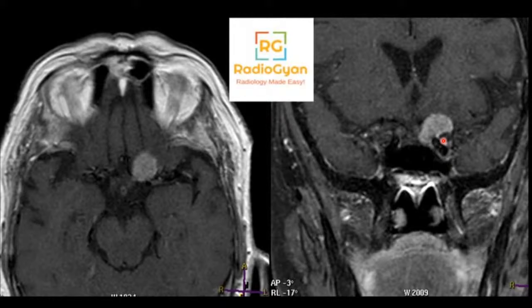Somebody said that this could be a trigeminal schwannoma. Again, that would be a bit more complex, and I'm not sure if this would be the location for a trigeminal nerve lesion. It could be one of the branches of the trigeminal nerve going through the cavernous sinus, but the trigeminal nerve would be more posterior and maybe at a lower section.